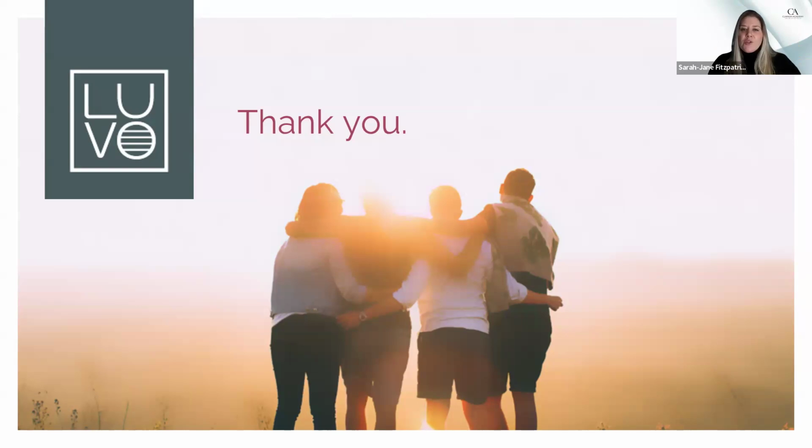Can we treat spider veins on the legs with the vascular settings? No, spider veins on the legs. I personally, if someone out there is doing it and you feel you're having success, well, then good for you. I'm not here to tell you what you can't do. Me personally, as a trainer, we do not train on that.